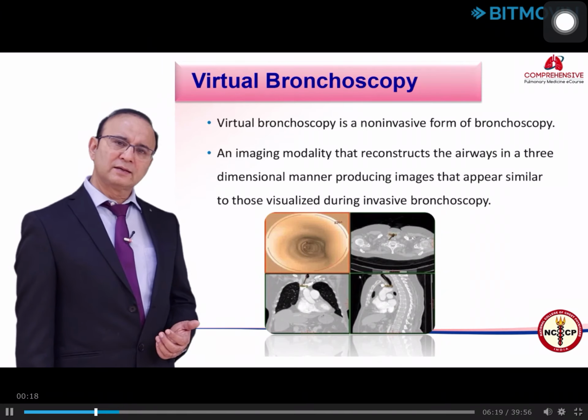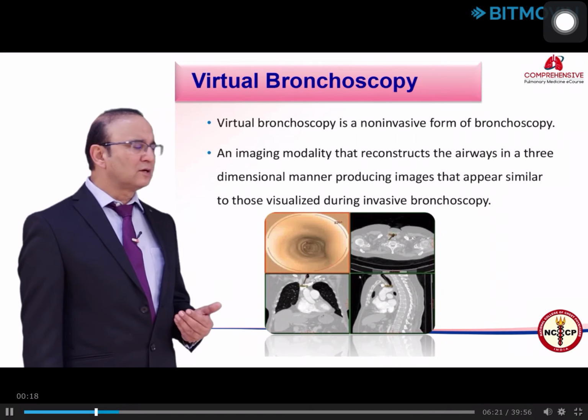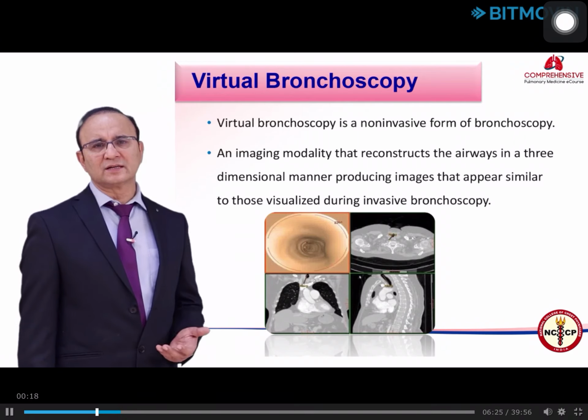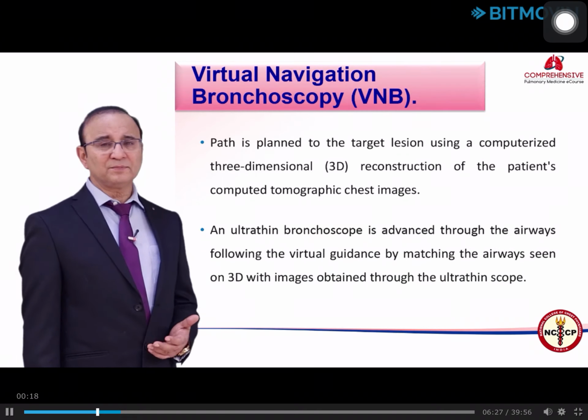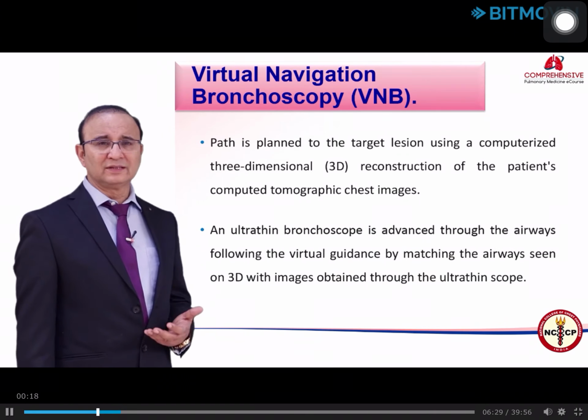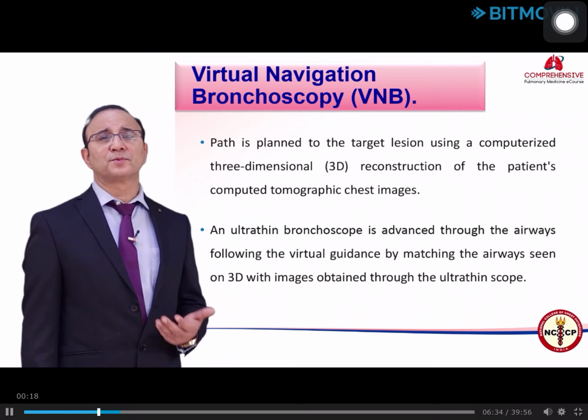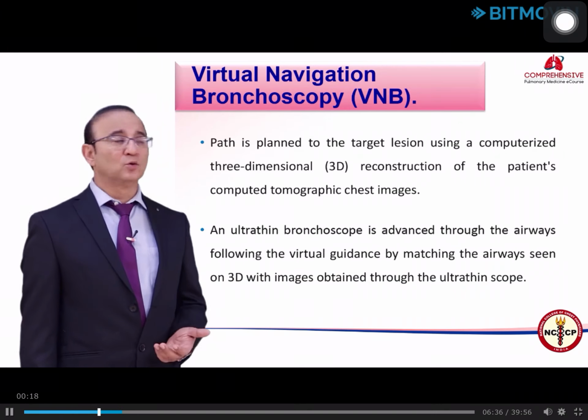Unlike flexible and rigid bronchoscopy, it cannot be used to acquire samples. Its use is limited to centers with expertise. It can be combined with virtual navigation bronchoscopy along with ultra-thin bronchoscopes to obtain samples from the lower airways.